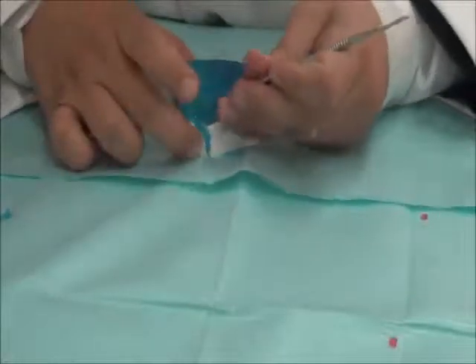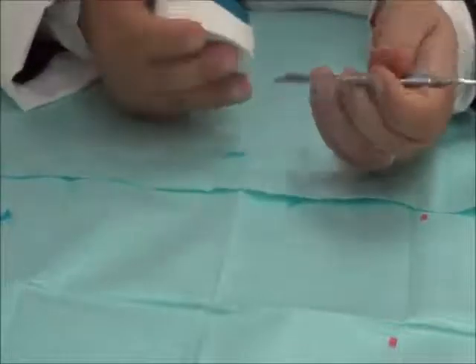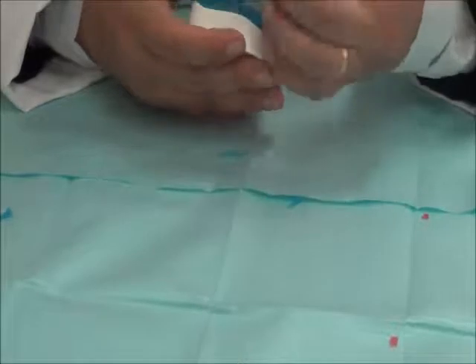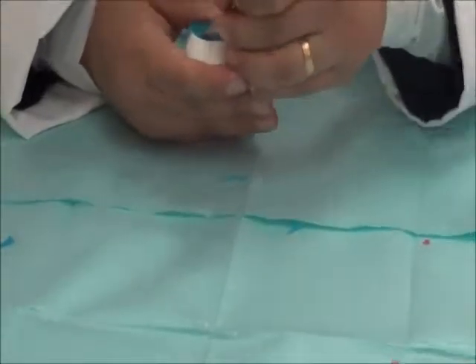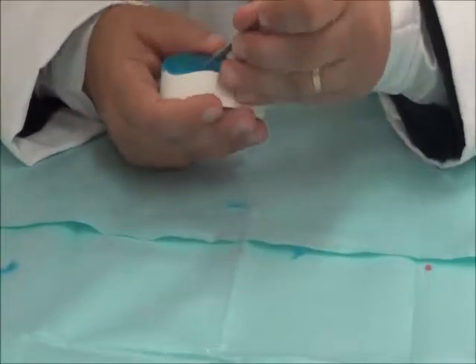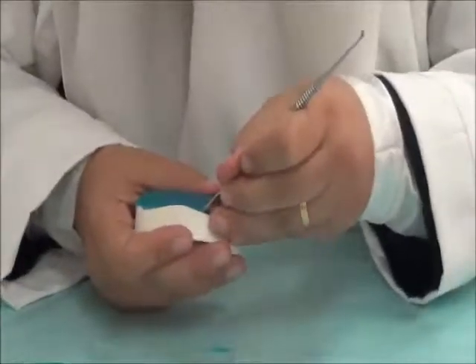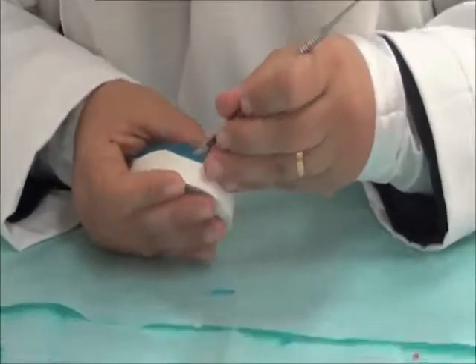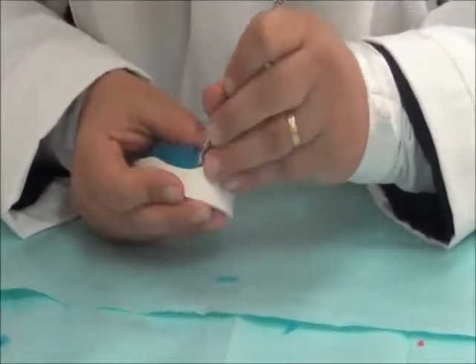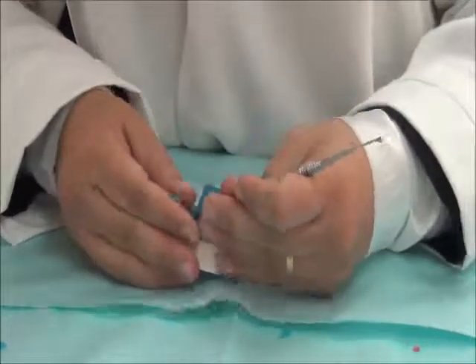Once we have all of the material in location, the material is adapted, and now we can cut to the line that we have drawn, which is 1 to 2 millimeters away from the sulcus. We're following the line. It's drawn 1 to 2 millimeters away from the sulcus, and we're removing the excess once more.